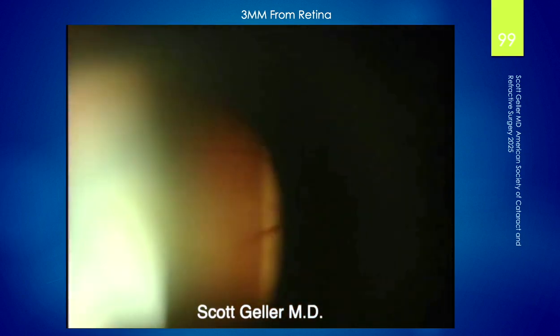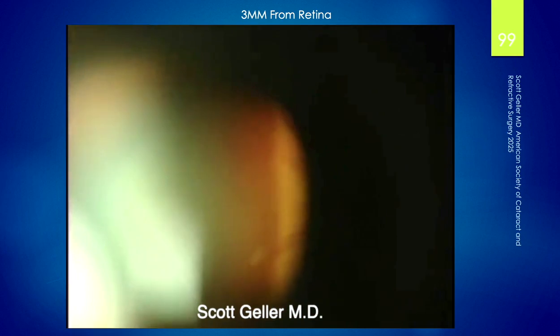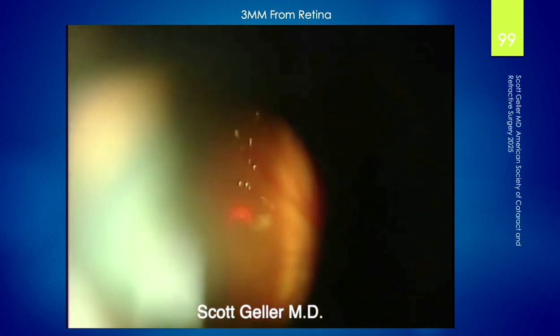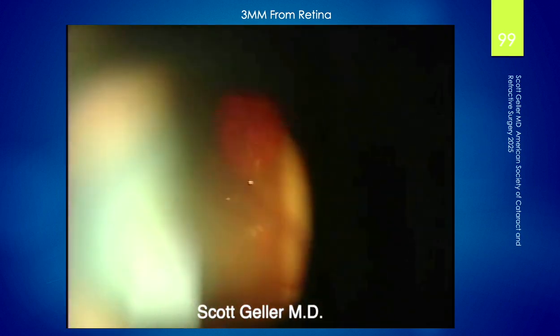Just be careful. And if you have an opacity like that, don't shoot over the fovea, because if you get a thermal burn to the fovea, you will have a partial blind spot, which I have never had, but obviously it can happen.